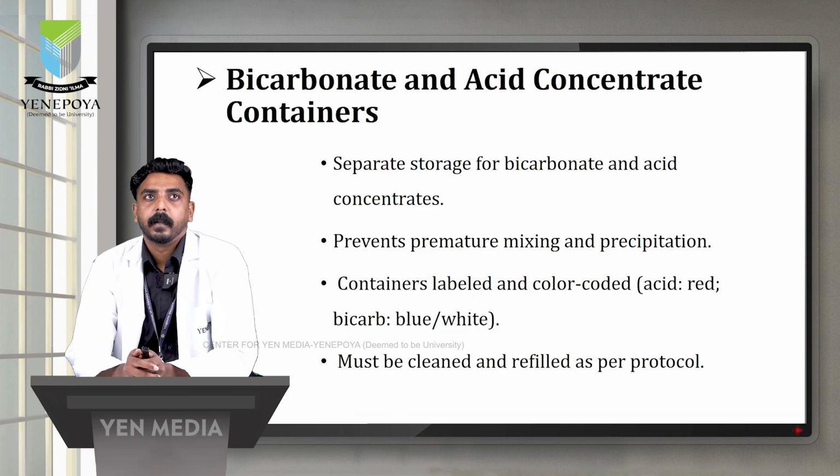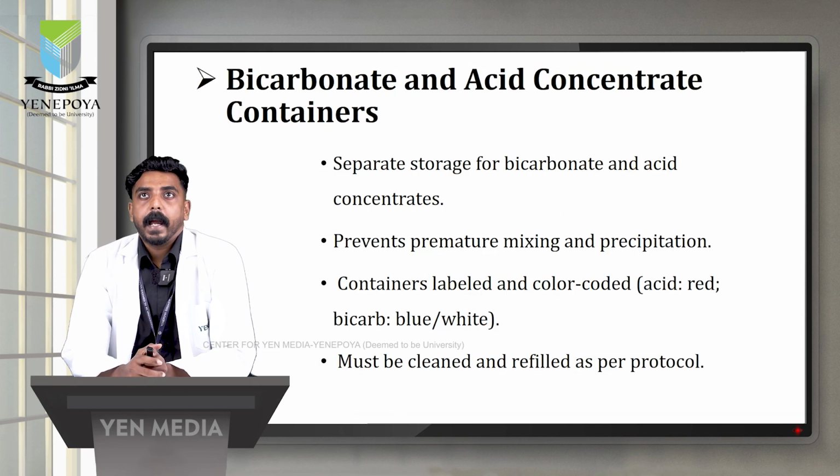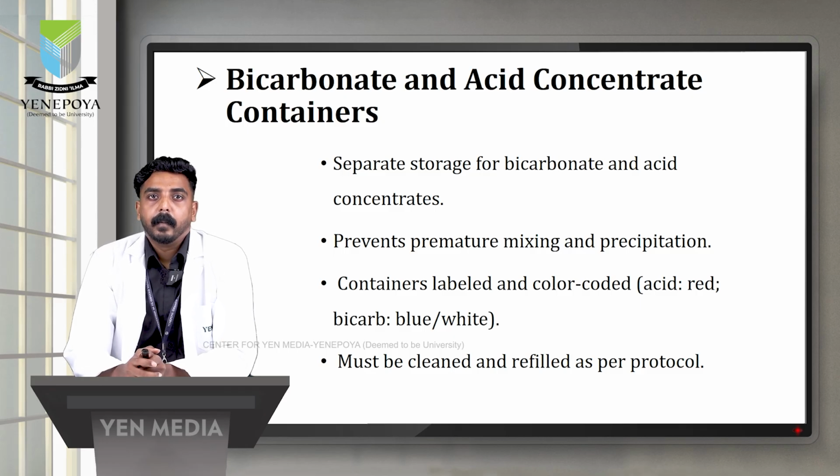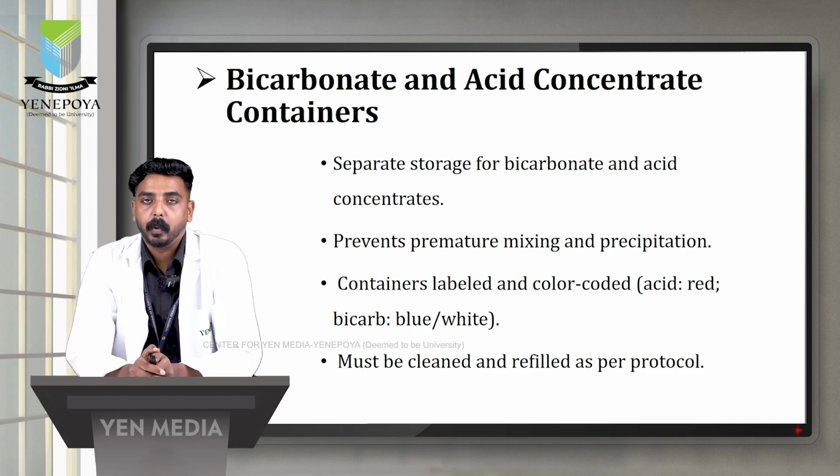Bicarbonate and acid concentrate containers. There are separate storage containers for bicarbonate and acid concentrates. It prevents premature mixing and precipitation. The containers are labeled and color coded. The acid is kept in red containers and bicarbonate is kept in blue or white containers. The containers must be cleaned and refilled as per protocol.